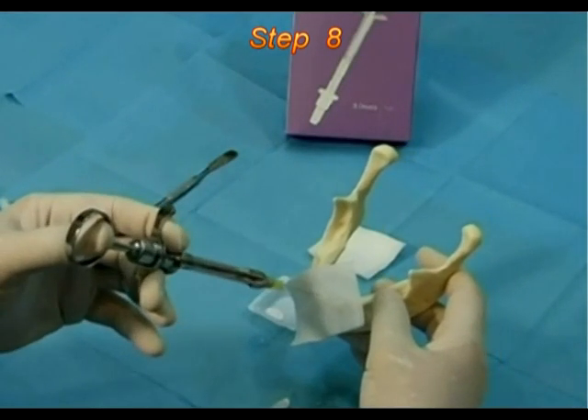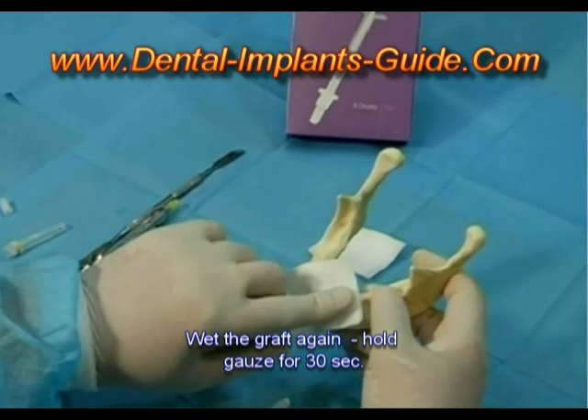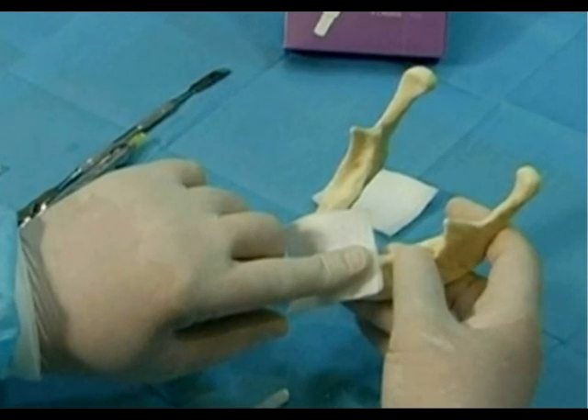Step 8: Wet the gauze pad with sterile saline and place it on the graft. Remove the gauze pad after about 30 seconds, then proceed with soft tissue coverage and wound closure.